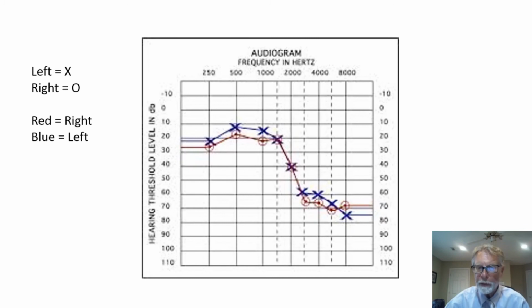And this is on the left ear. They got it at 20. They went to 10. They didn't get it. Then they went up by 5. So it's down 10, up 5, 15, and they got it. Then they dropped down below that by 10, came up by 5s, got it at 15 again. 15 is the threshold, right? That's the method, that down 10, up 5 method.